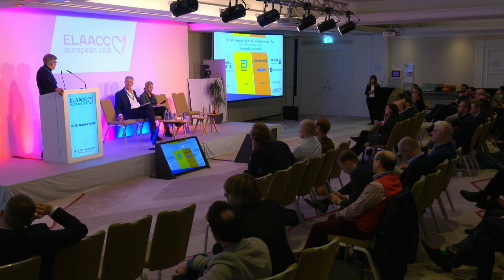There is new thinking in this device, and also the simplification of two sizes. If it really works and creates sealing in most of the cases, it's quite attractive, I think.